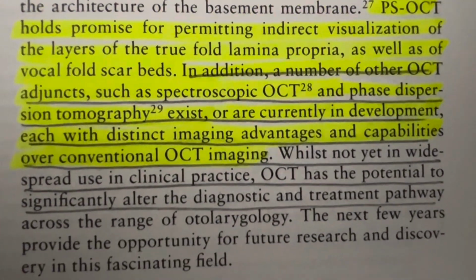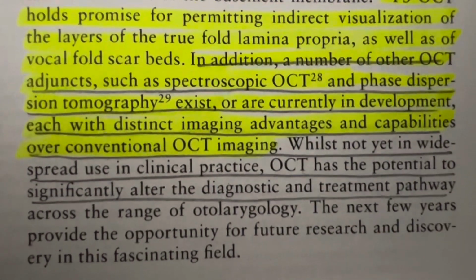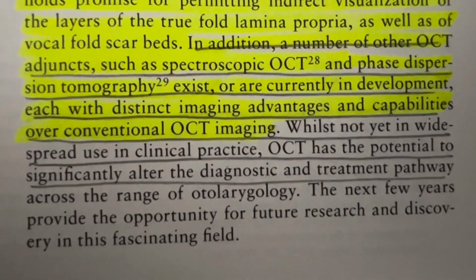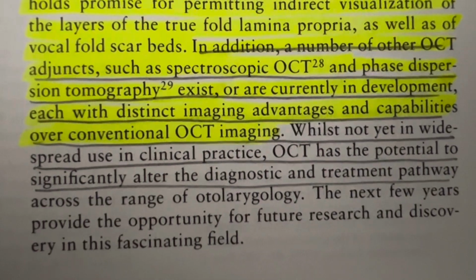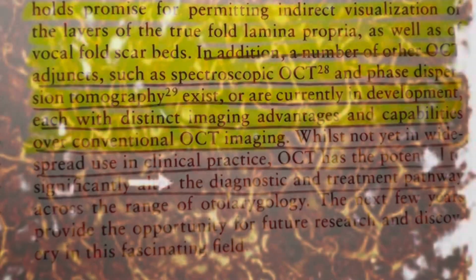While polarization-sensitive OCT holds promise for detailed layer structure of the true vocal folds, there are new technologies like spectroscopic OCT or phase dispersion OCT currently in development.